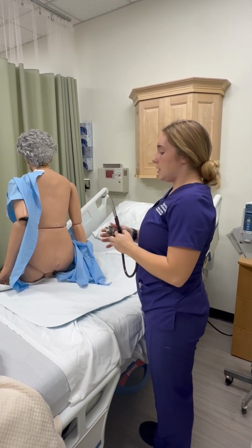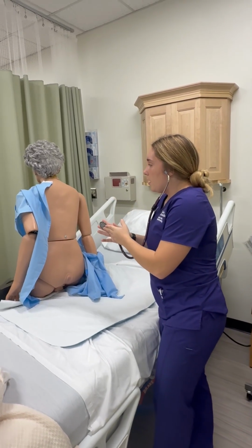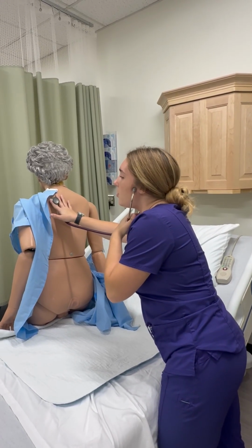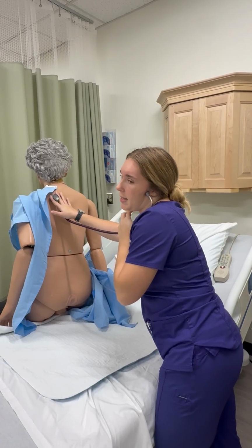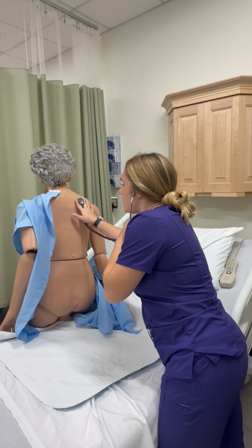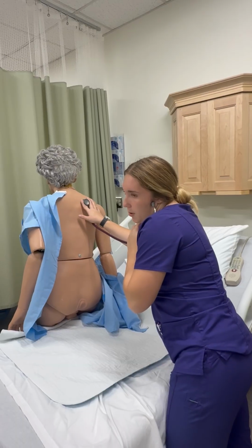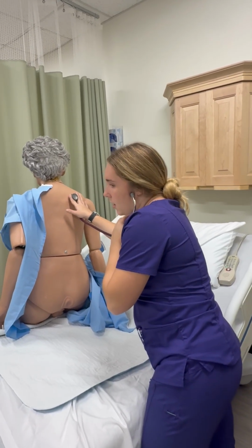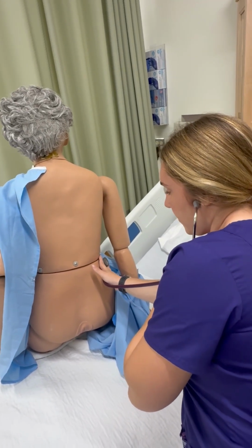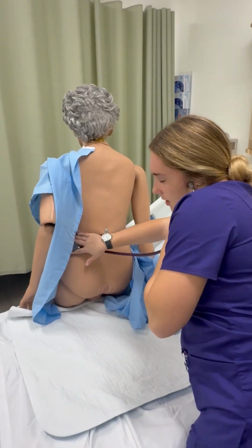So I would then listen to their back lung sounds. I'm going to start at the left upper lobe, about 3 inches away from the spine around the C7. I'm going to have them take a regular breath in and out before I move my stethoscope. I'm going to do this again on the right side, again around 3 inches away from the spine. I'm then going to move in a ladder position, so I'm going to go down to the right lower lobe in the mid-axillary line. From here, I'm going to listen to the left lower lobe again in the mid-axillary line.